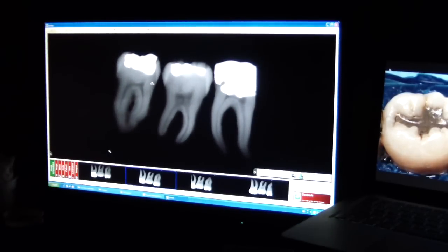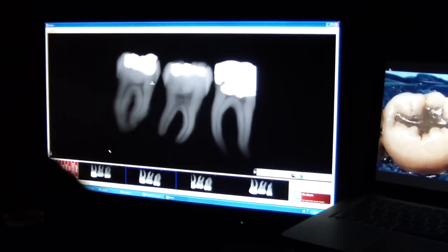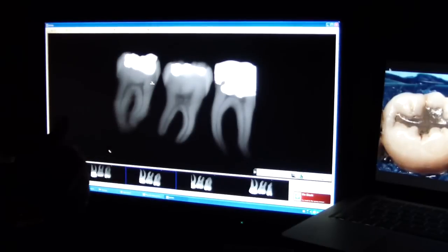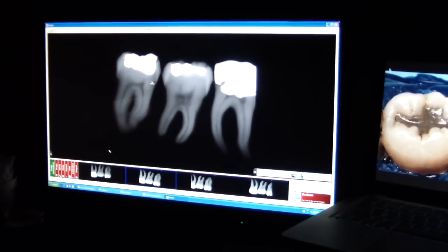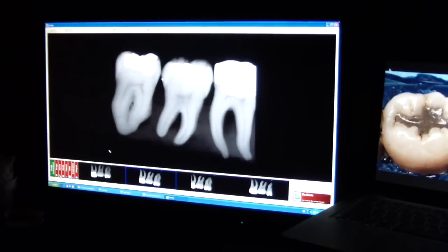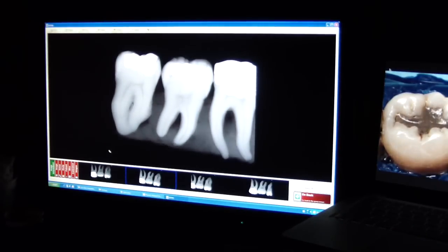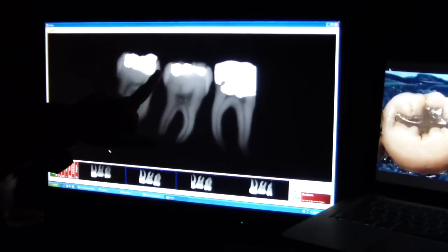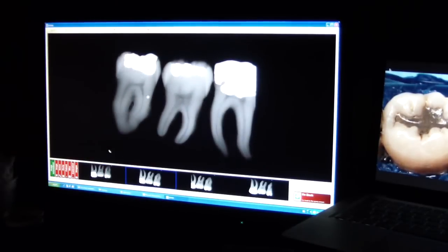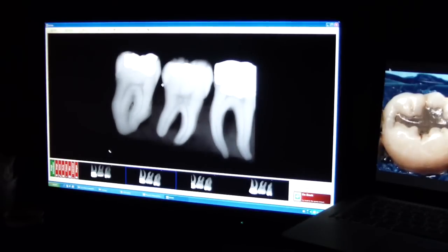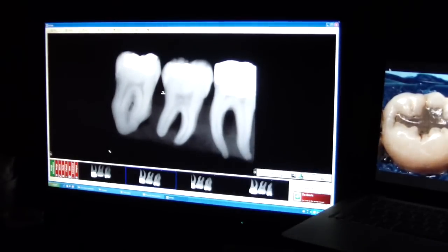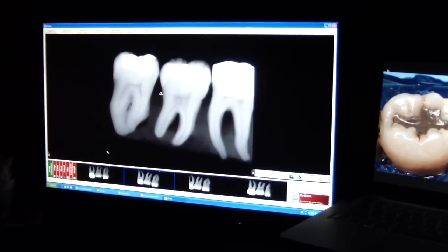The problem with digital radiography is that one clinician might look at a lower contrast image while somebody else will prefer a higher contrast image. A high contrast image means you can see the enamel and the dentin clearly. A low contrast image is where you cannot differentiate between enamel and dentin. So change the densities and contrast when you look at a digital image.